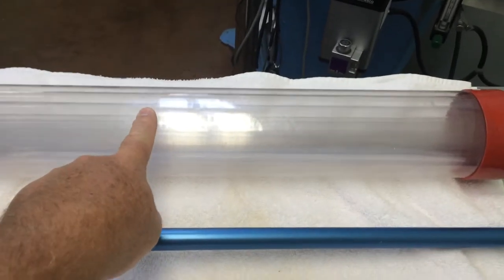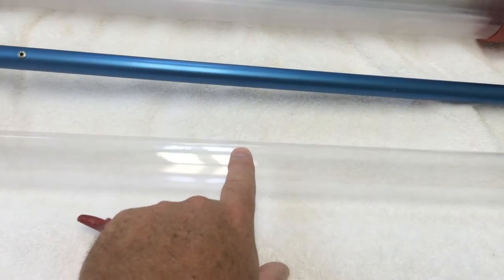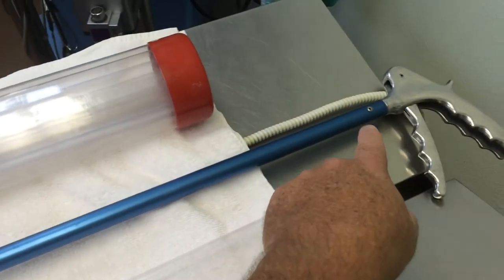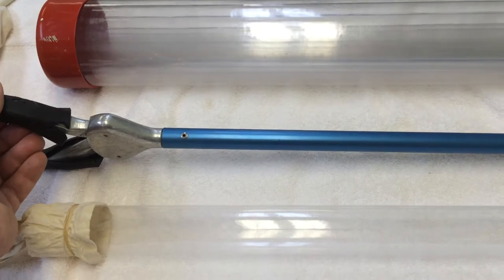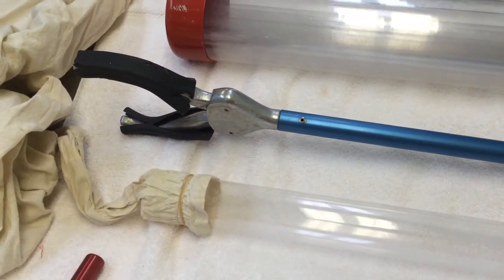This is basically a series of about 13 different size tubes. Today we're going to choose this size to work with the snake. Here's part of our tongs. I like this brand, or this type, because it's got the soft parts on the tips, and it also doesn't completely capture them and hold them. It's just basically something to guide them.